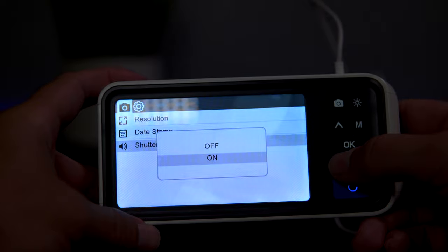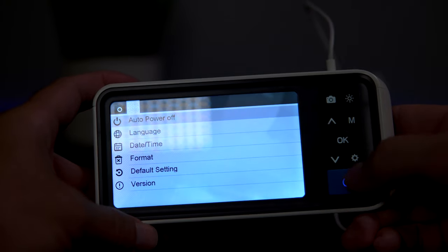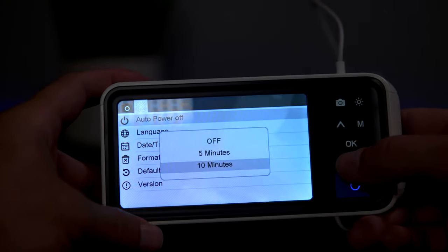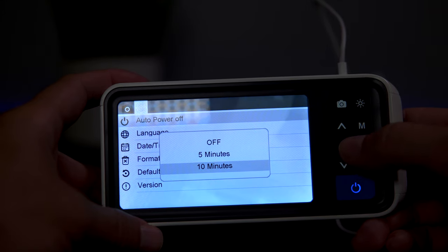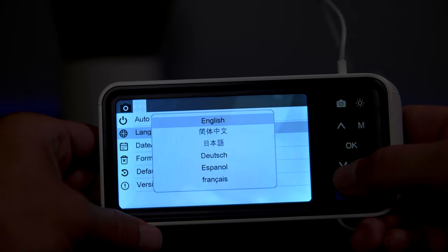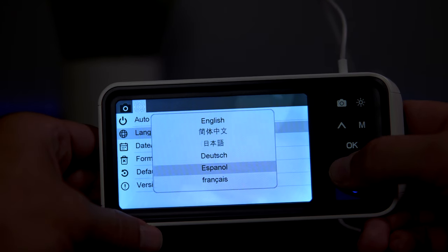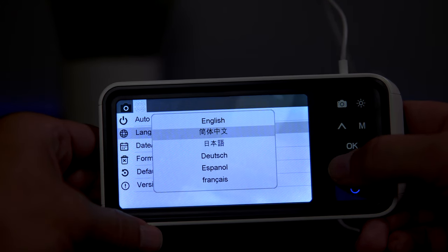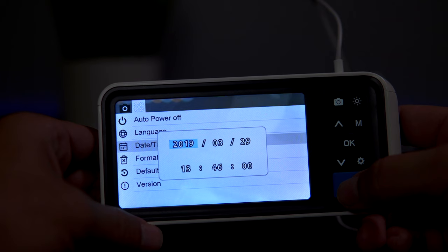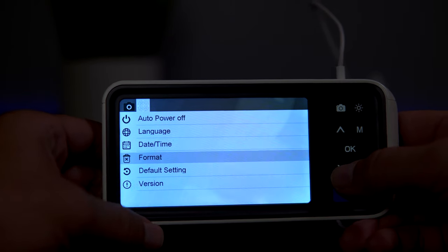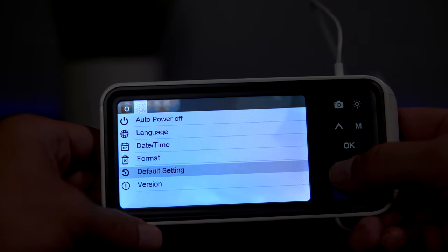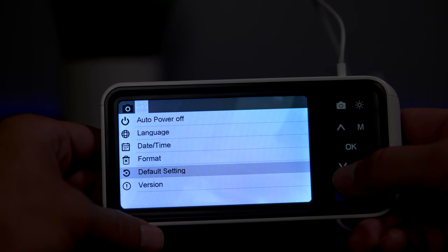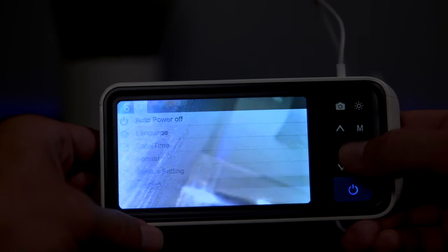If we click M, we go to the next tab. Here we have auto power off—we can set that to five or ten minutes or turn it off. We can change the language. These are all that are available, quite a lot of them actually. Here's where we set our date and time. We also have an option to format the SD card if we want to, and we can reset the device to default settings.